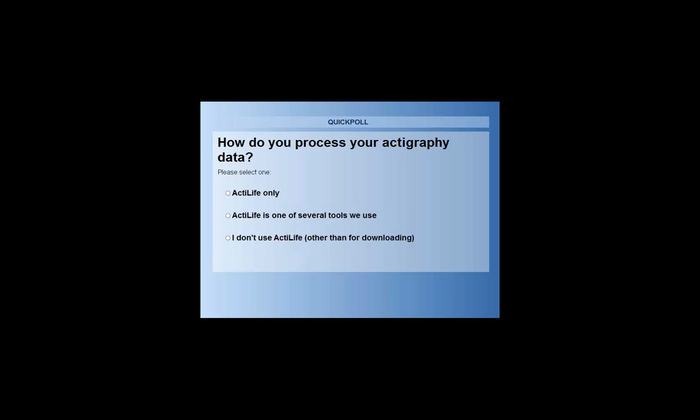We're interested in what you use ActiLife for. Do you use it in the middle of your processes as your only source of processing your data, or is it one of several tools, or do you not use it at all and use some other tool? All right, so we've got about 66%, 70%. We'll keep it open for about 10 more seconds.